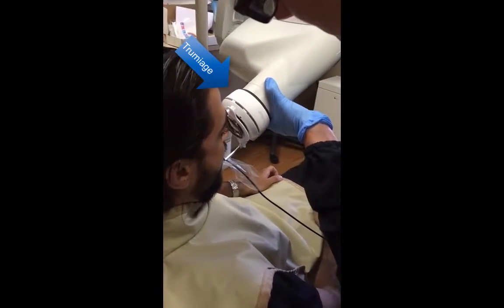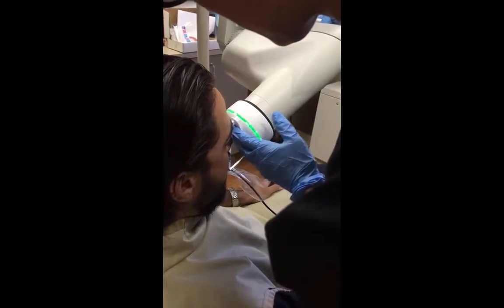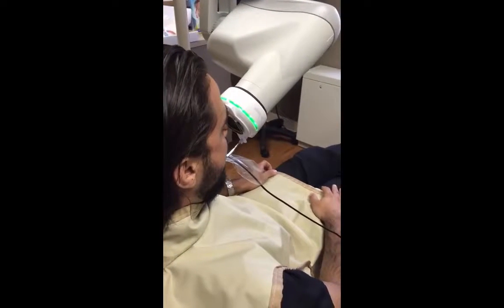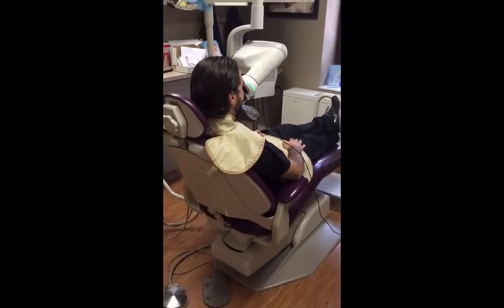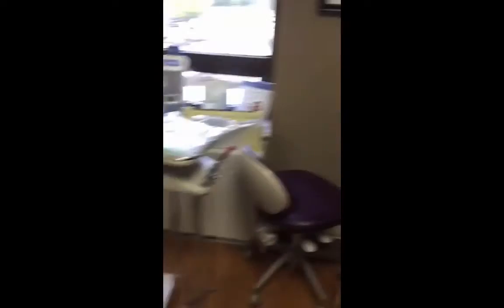Once you line this up straight, the green light will go on. When the green light goes on, that means you're lined up accurately and ready to shoot. Now the x-ray is going to be taken and we're going to show you what this looks like on the screen.